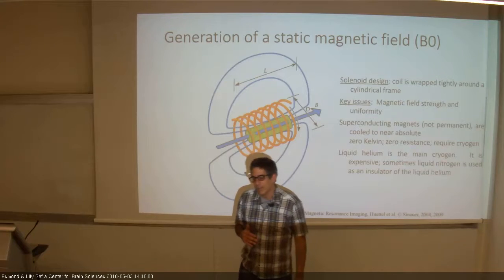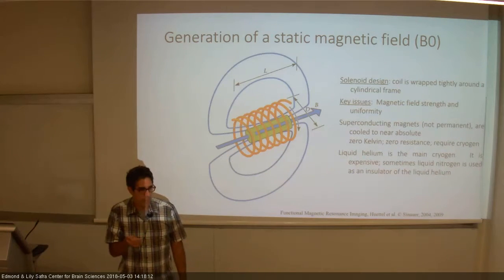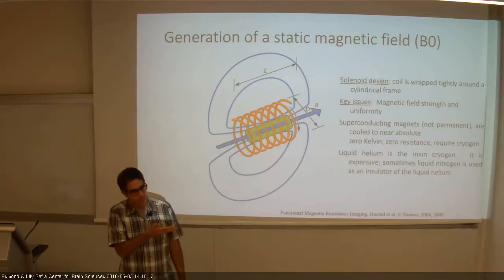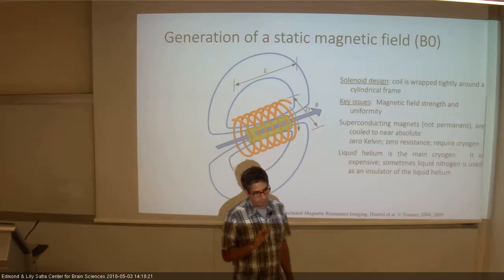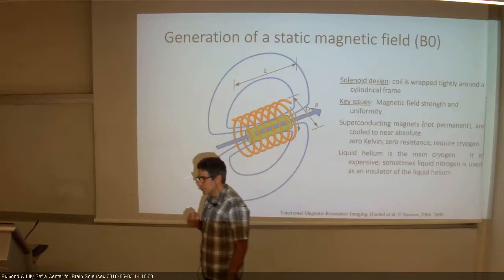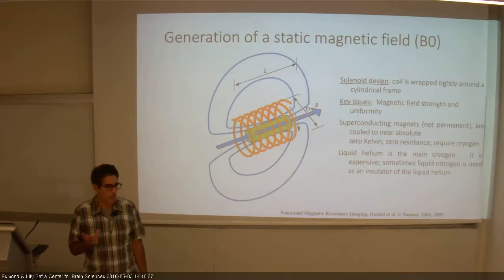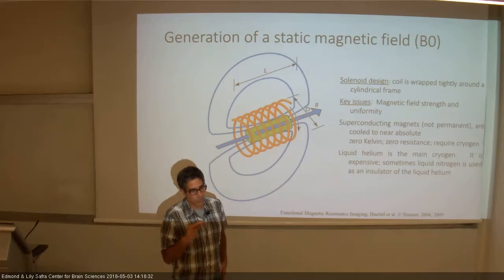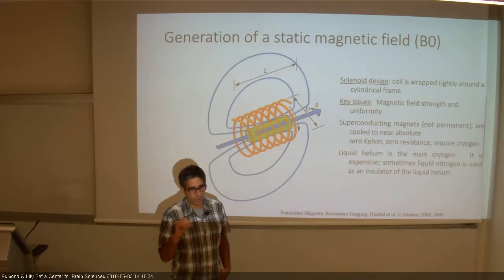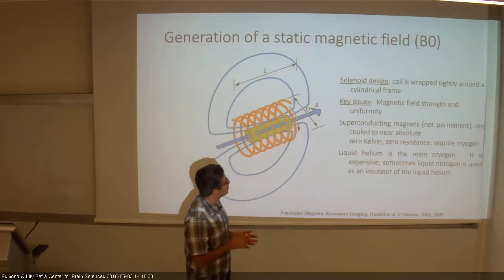Now, you might think that we're constantly injecting tons of current inside, so there is a huge demand of electricity in a magnet in order to create this huge magnetic field. The reality is that we're actually not doing it in that way. The way we're doing it is we're using materials we call superconductors. Maybe you heard about it, maybe you don't. When they are really cold, close to 0 Kelvin, super cold, they are superconductors, and they have almost no resistance or 0 resistance.